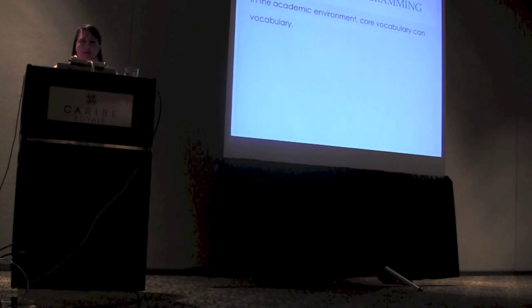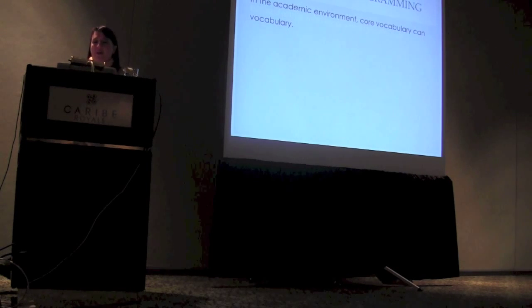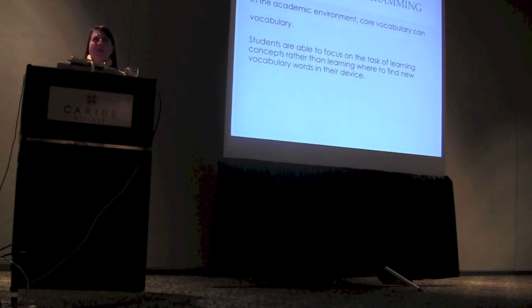So in the academic environment, core vocabulary can be used rather than spending all your time programming the curriculum vocabulary. I know from being in an academic environment that you can spend hours programming in osmosis and patriotism. If you're focused on core vocabulary, students are able to focus on the task of learning the concepts rather than learning where to find the new vocabulary words in their device.